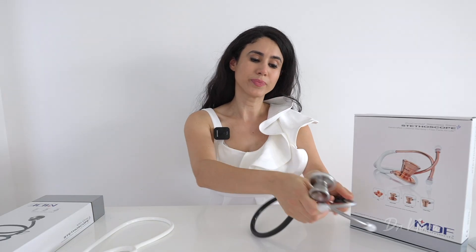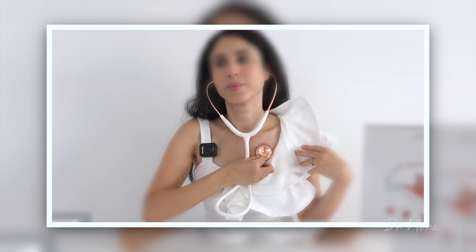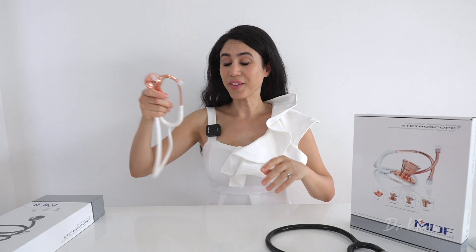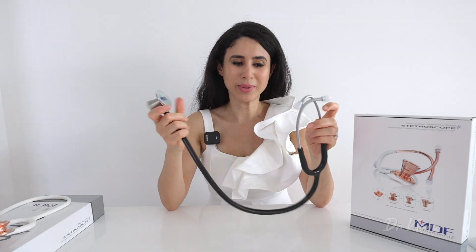That's the Procardial and the MD1. Wow, I think there is a bit of a difference there, which is really interesting — but let me know what you guys think in the comment section below.